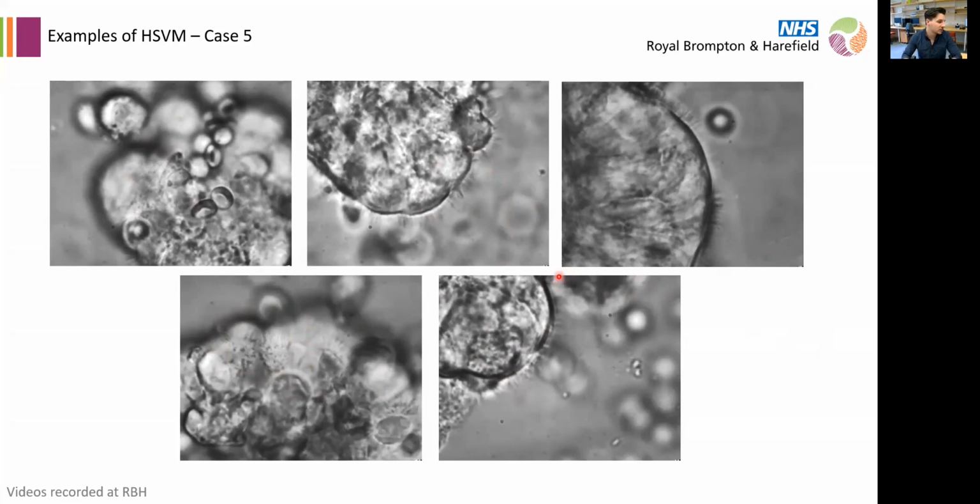It's slightly hard to see, but we can guess some kind of rotational pattern, I believe, in this video when you are used to seeing it. And so a rotational pattern probably means central pair defect. And there is actually a really pretty TEM that suggests exactly that. So this patient had a central pair defect.